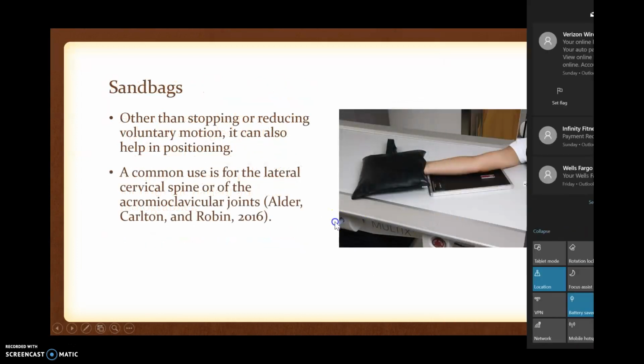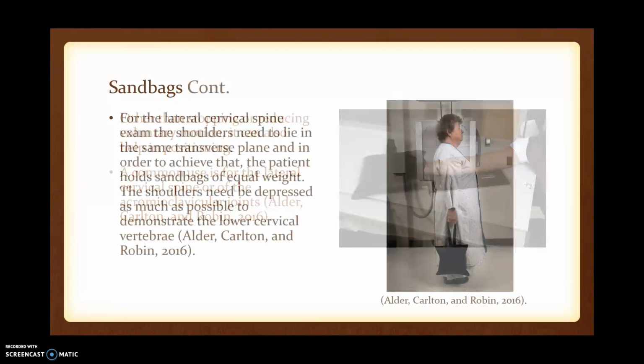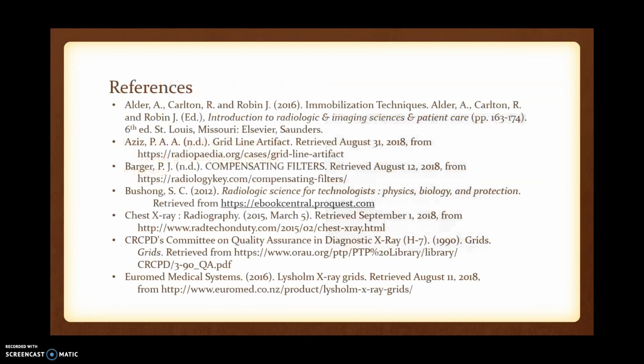And then immobilization devices can help prevent motion, voluntary and involuntary, and help align, as you can see.